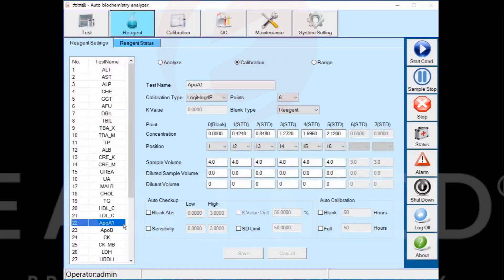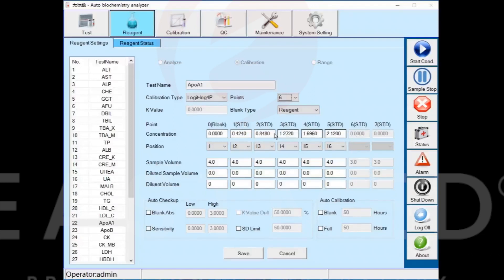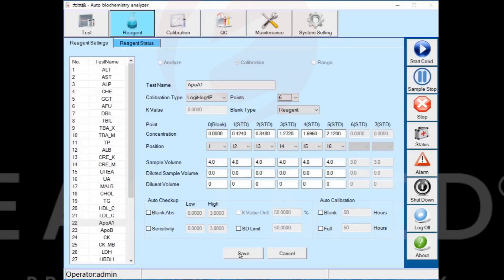For multi-point calibration projects, here we use log 4P. Select the number of calibration points, enter the corresponding concentration, specify positions of calibration solutions of different concentrations, and make sure sample volume is the same. Click the save button to save.